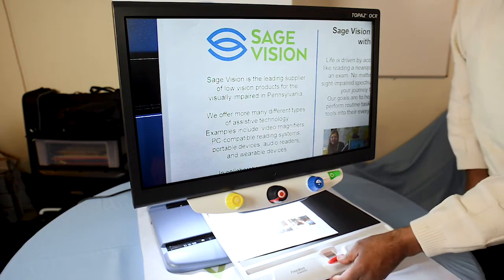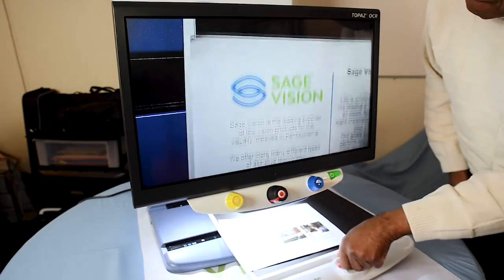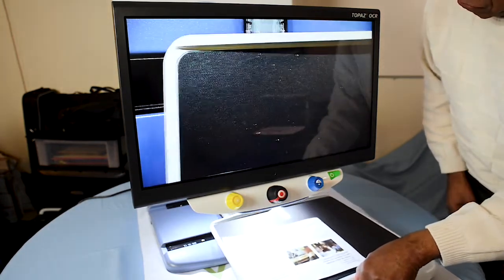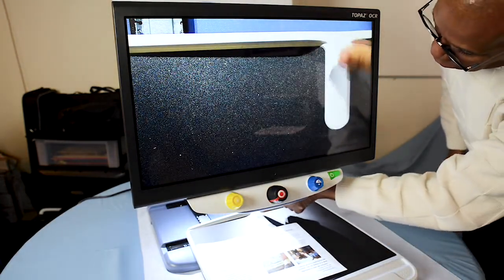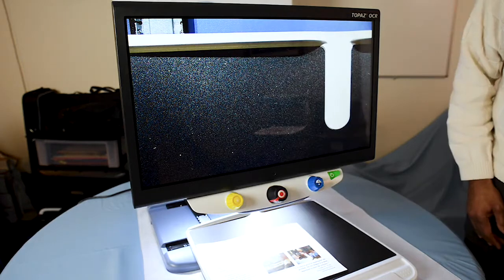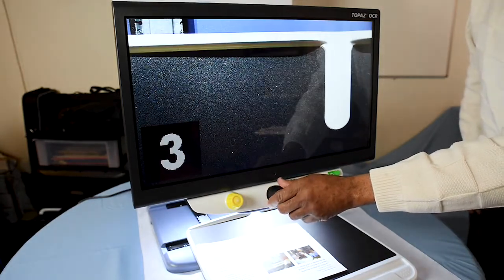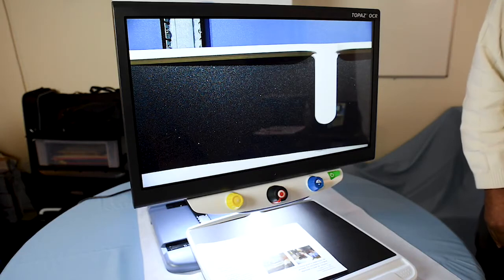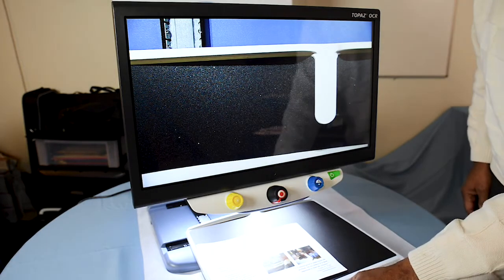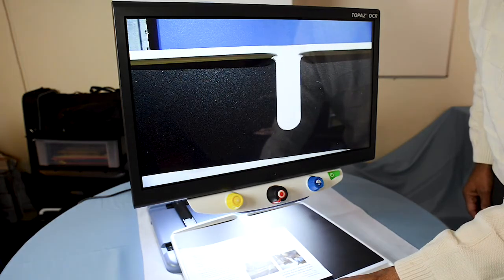Another feature within the XY table that's really nice is this white groove here. This white groove is great for medications, beauty supplies — anything you'd like to magnify on the XY table that might roll around as you're moving it. The groove enables the medication or beauty supplies to stay in place as you're moving the XY table.